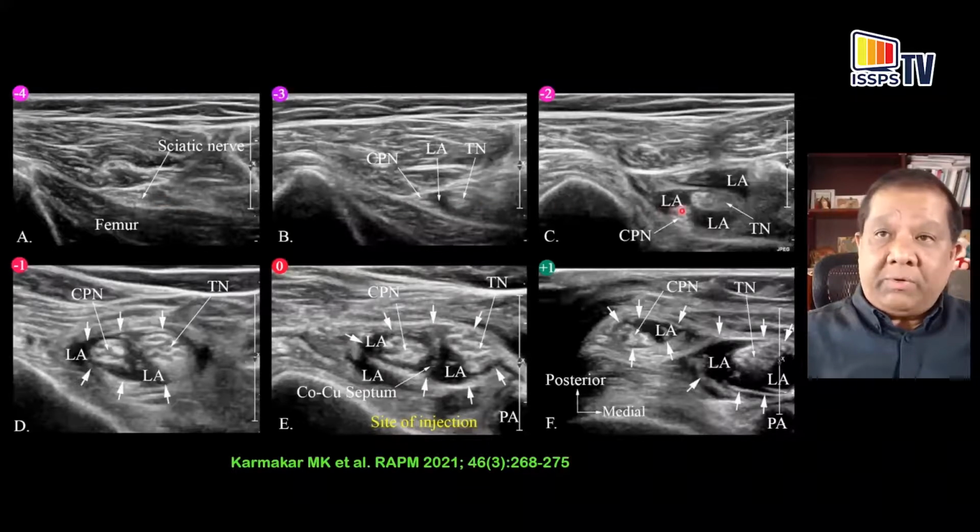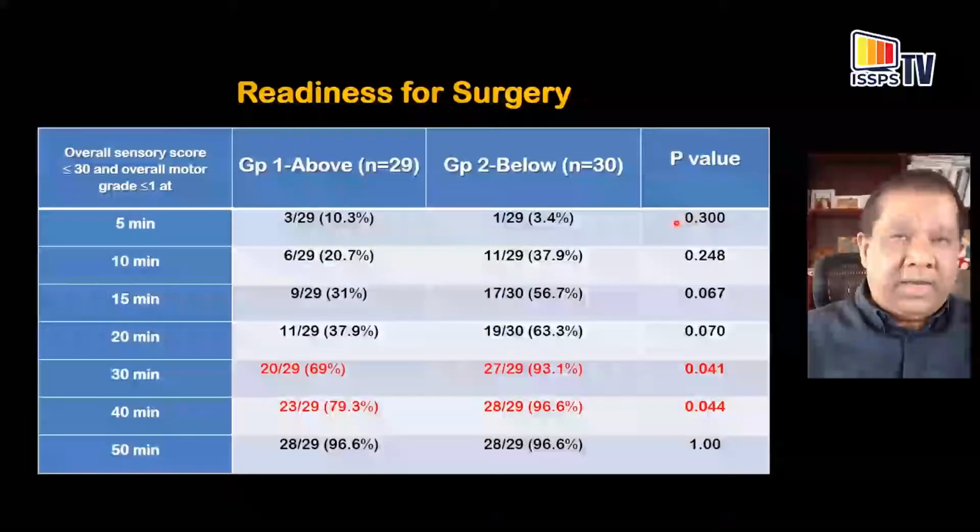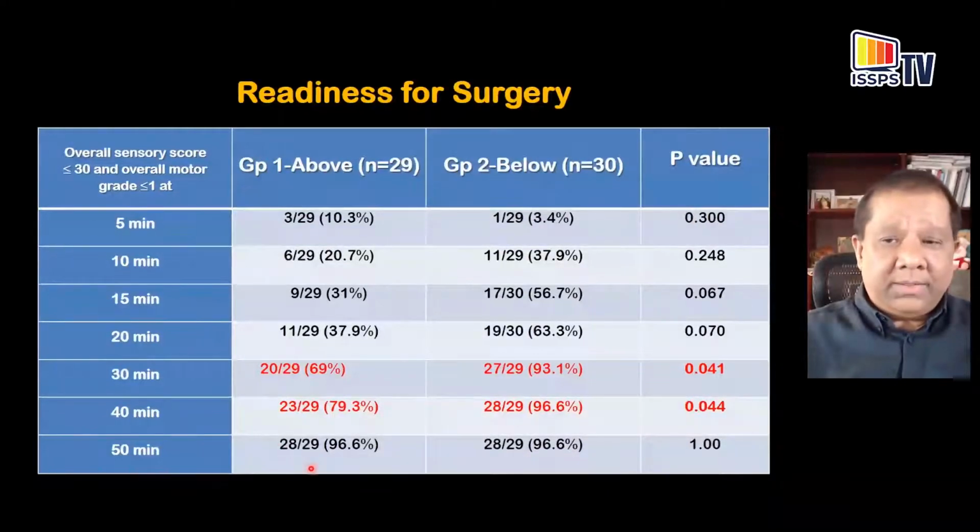When you see such separation, there are two questions that came to my mind. Is it an intraneural injection? Certainly not, because we've done a subparaneural injection. Again, why are these two nerves separating out? This is the next question. I will come to that in a short while.